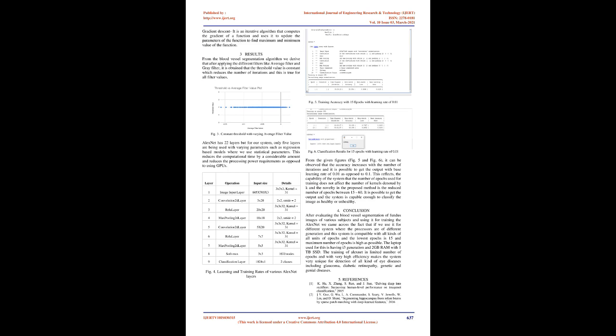Convolution layer has a large number of filters which is used for filtering, and it is characterized by the height and width, and we have used 2D filtering for this method. For the 2D filtering, we have not taken more than 20 filters, each having a size of 5x5 dimensions.